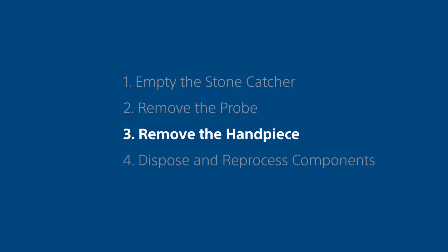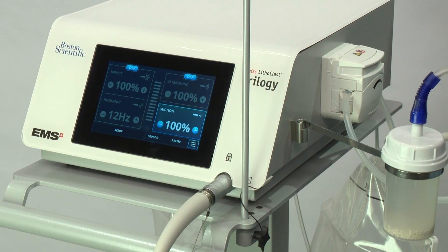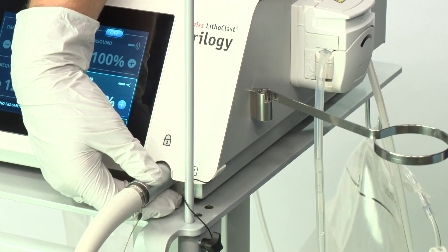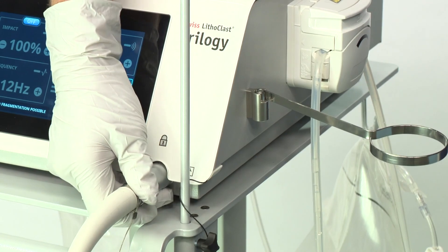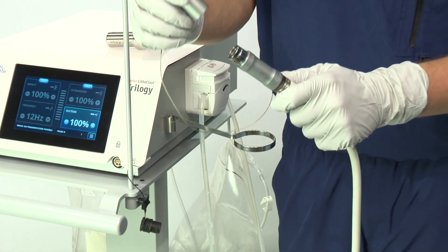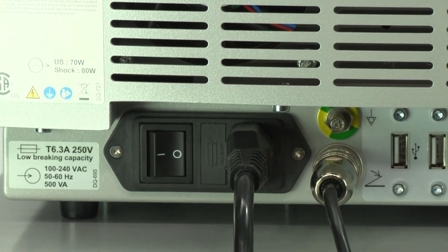Step 3: Remove the handpiece from the unit. Wait until the lock icon switches off. The handpiece cannot be disconnected when the lock icon is on. Pull back the metallic part of the handpiece connector to disconnect the handpiece. Place the protective cap onto the handpiece connector. Switch the power off on the rear of the unit.